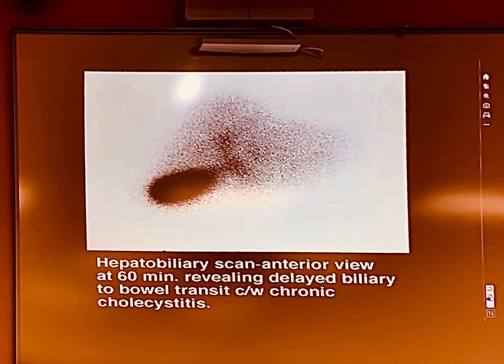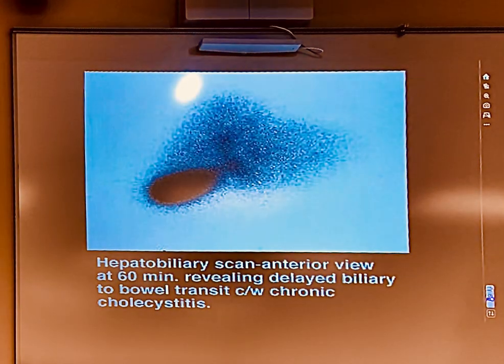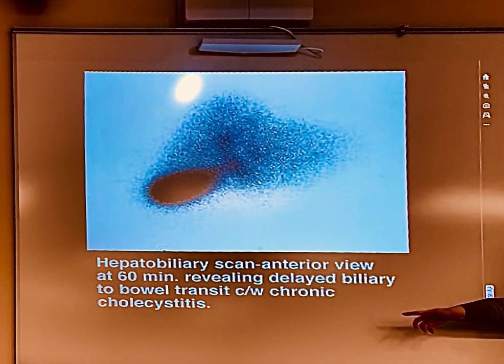Would she put it as consistent with chronic cholecystitis? I don't think I would, as a radiologist, feel comfortable saying that's chronic at 1 hour. I would say the patient probably has a common bile duct stone. The patient could have had pictures after this, and that's how we got this report, right?